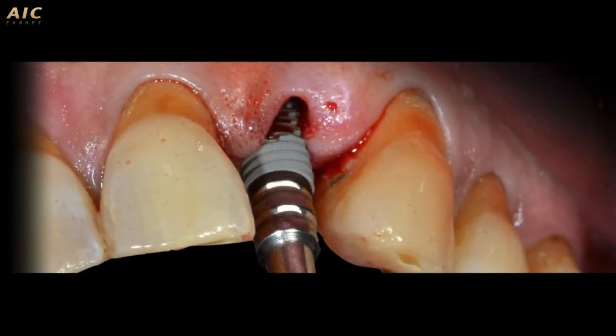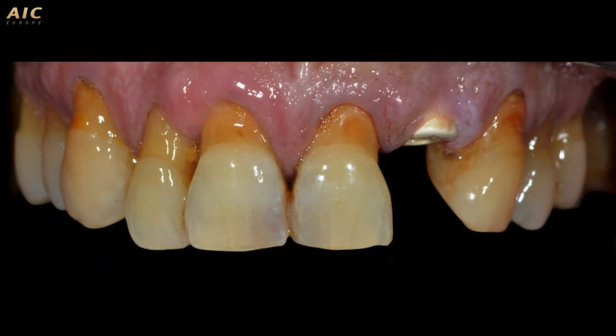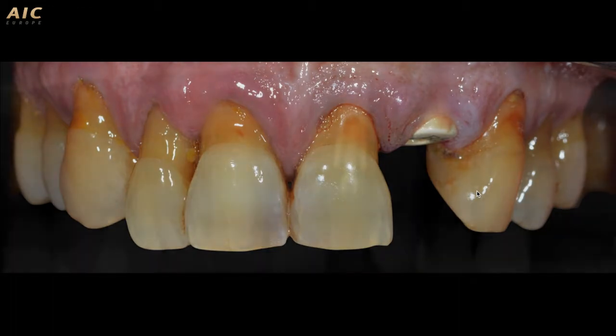We put the implant in a prosthetic way, following the normal root of the extracted tooth, and at the same time we put the healing abutment. I like to use this kind of healing abutment, the PIC, because we can change the emergence profile of the soft tissue.